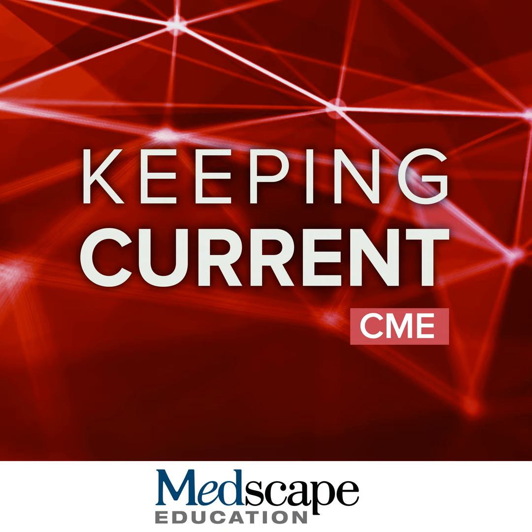And the other part of this is that we know that sometimes abbreviated MRIs can find nodules that are occult on ultrasound. So on your left, you have an ultrasound there. Now, this was not seen prospectively, but in retrospect, you may be able to make out possibly a nodule there. Even knowing where it was, it's hard to see that nodule.